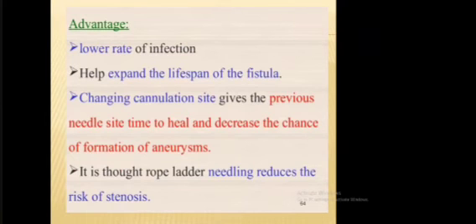Advantages of the rotation technique: lower rate of infection and it helps expand the lifespan of the fistula. Changing the cannulation site gives the previous needle site time to heal and decreases the chance of formation of aneurysm. It is thought that the rope-ladder needle technique reduces the risk of stenosis.